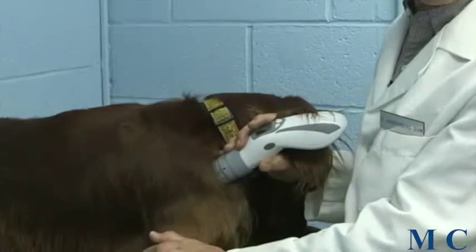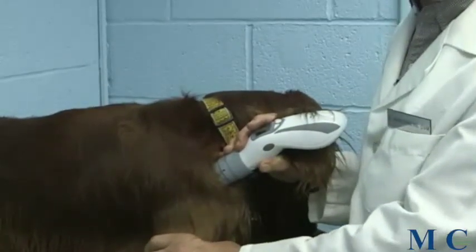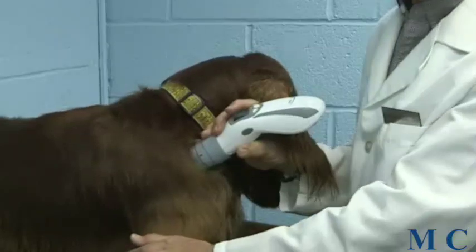Roughly what we do is treat for about a minute. The parameters we like to use here are about 50 milliwatts per centimeter squared. We use other units that are lower than that, but that generally is typical, and at that point we treat this area for about a minute.